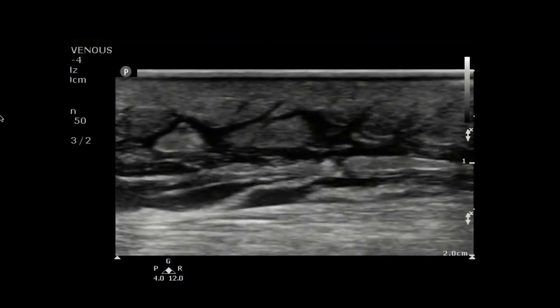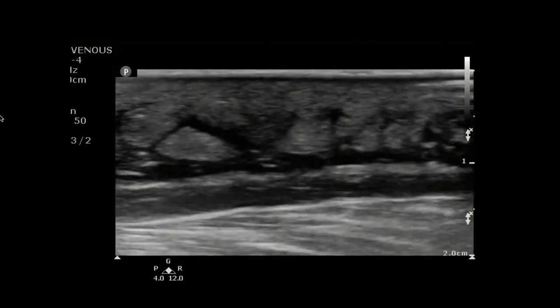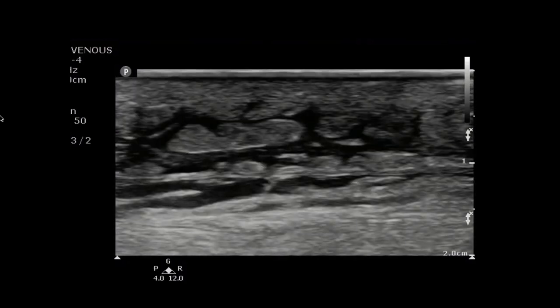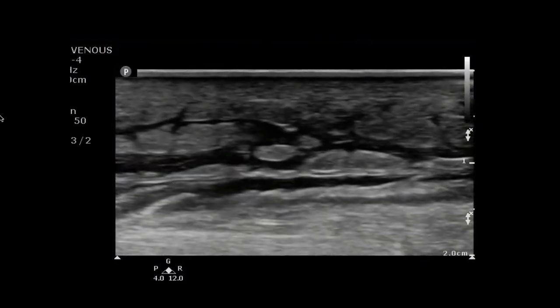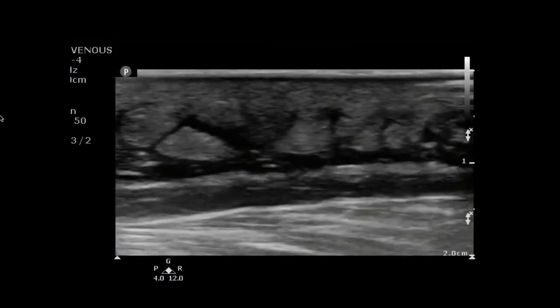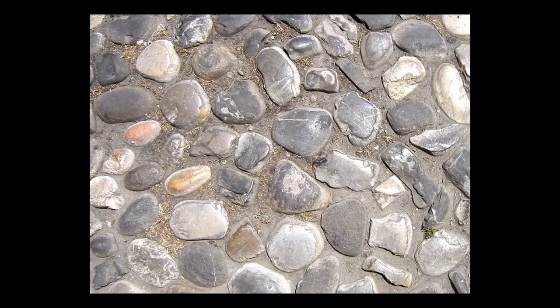Now this is what cellulitis looks like. Notice the islands or pockets of hyperechoic soft tissue surrounded by hypoechoic or dark fluid. This indicates inflammation around the area, which would be indicative of cellulitis. This finding looks so much like cobblestones that if we see something like this on ultrasound, we say it's cobblestoning — and cobblestoning is synonymous with cellulitis.